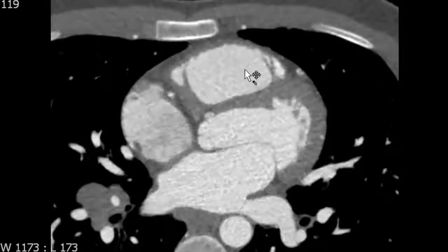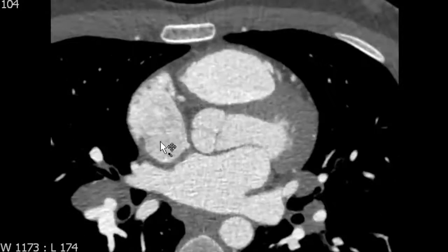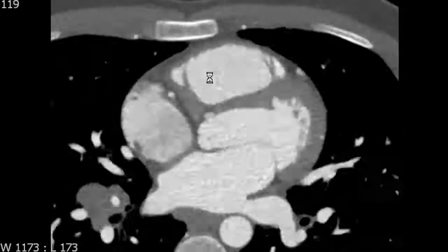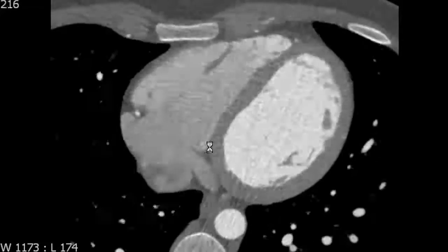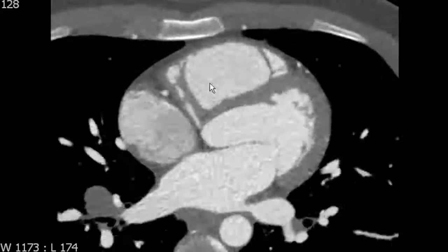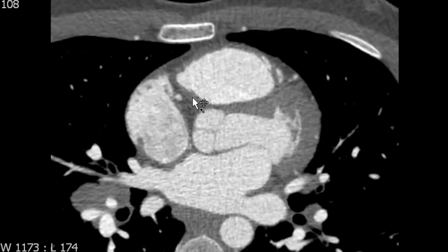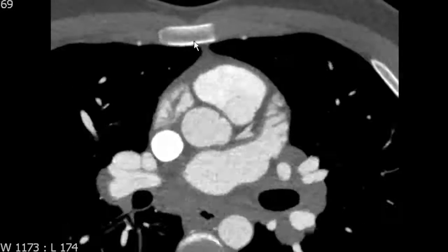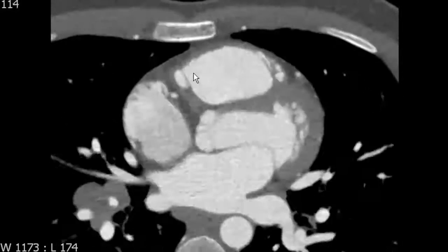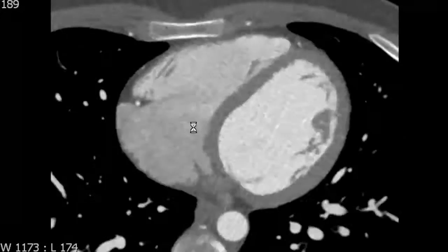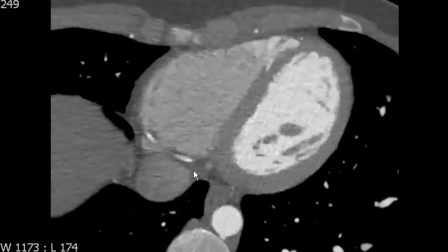Next we're going to review the right atrium. As we scan through, we can see that the right atrium is composed of two main anatomic components. The first is the trabeculated component. We can see as we look at the free margin of the right atrium that there are little trabeculations, which show up as linear opacities that come in and out of the slice you're looking at. That's the first anatomic region of the right atrium.